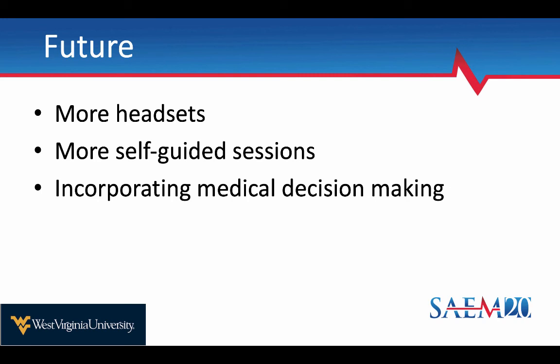And we should probably mention one of the limitations of the self-guided sessions is the glasses themselves. They don't always work right when you first put them on. A lot of times you need some other technical support to help you troubleshoot the glasses and why maybe you aren't seeing the 3D images that you should see. So as that technology advances and becomes more just put it on and it pretty much always works, I think that will increase the access and the use as well.